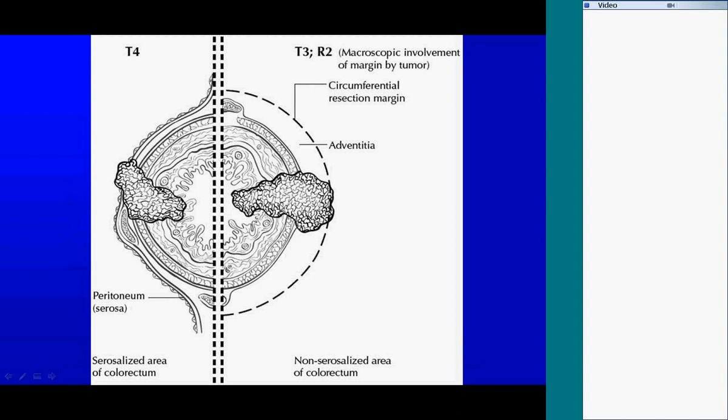And this leads to a little bit of confusion when we're evaluating the rectum, because we can have the situation where the tumor extends entirely through the specimen, involves the dissected surface of this margin, and the tendency is to want to call it a T4 lesion. But remember, there's no serosa in most of the rectum, only up at the very proximal most end of the rectum could you have any peritoneal covering. And so generally this is a T3 lesion into the perirectal fat with margin positivity.